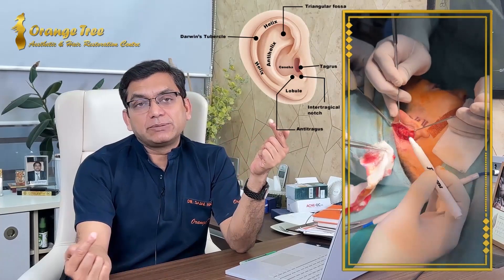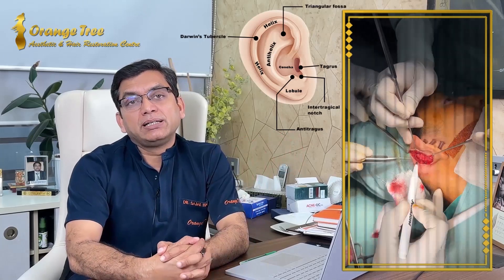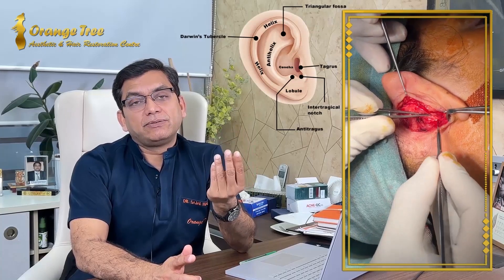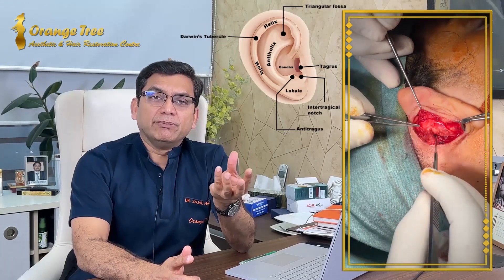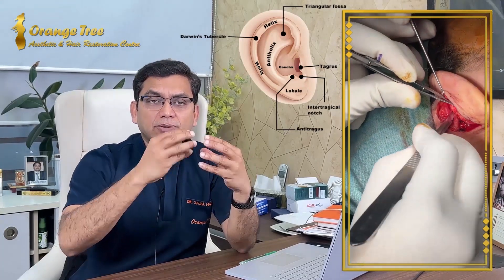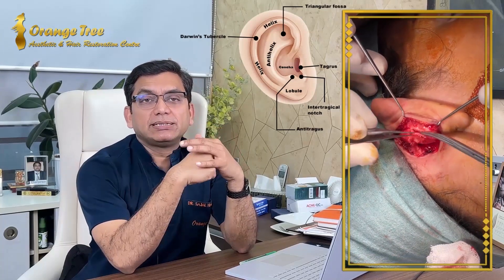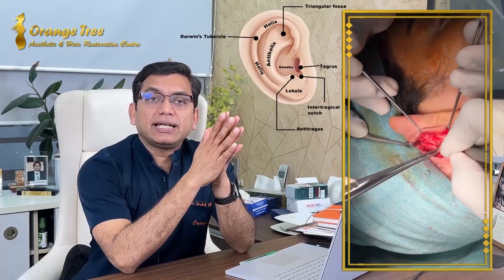Once the needle is passed through and through, we connect the dots with a marking pen, and thus the whole piece of cartilage is outlined for removal. The cartilage will mainly consist of the cymba and the cavum. This is a circular piece of cartilage, and we preserve the important landmarks: the root of the helix and the antihelix superior and inferior crura and the stem.